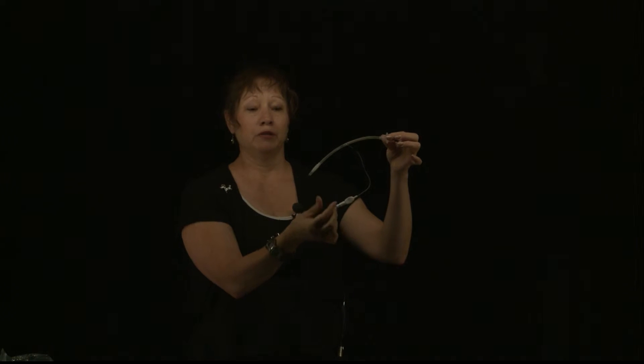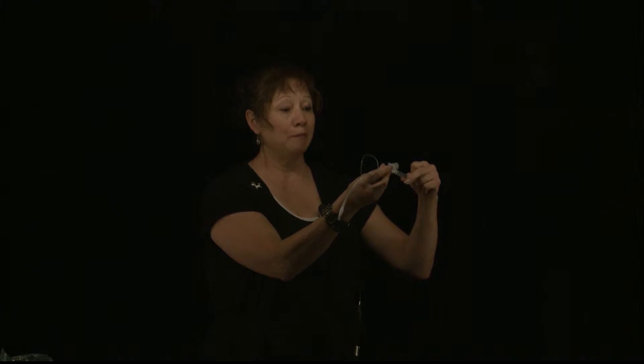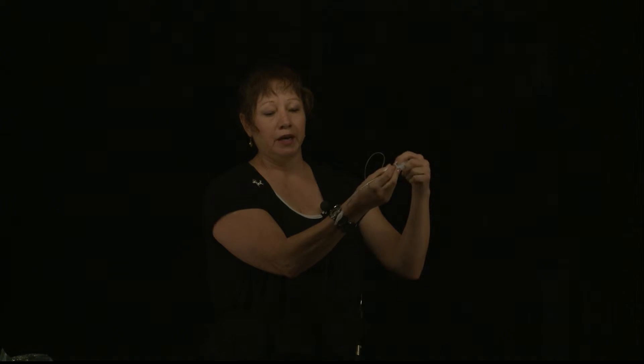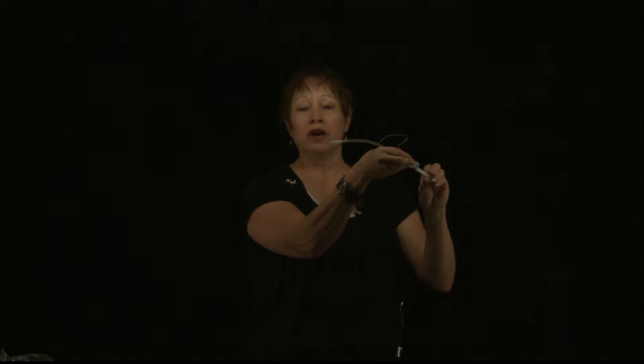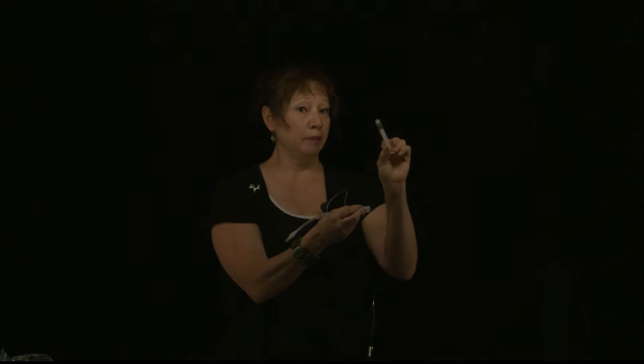With the smaller endotracheal tubes — for example, a 4.0 millimeters in diameter endotracheal tube — you want to be extremely cautious and careful about inflating this cuff. Cats and small dogs, toy breed dogs, are very sensitive to the amount of air that's in that endotracheal cuff. If we put roughly 3 millimeters of air into this cuff, you can see that it's largely inflated. In this situation, when checking the seal on our machine and our animal, we want to go at even smaller increments — half milliliter to a milliliter increments.